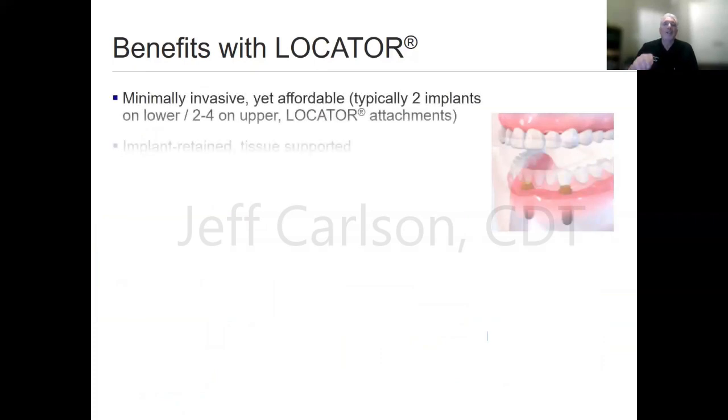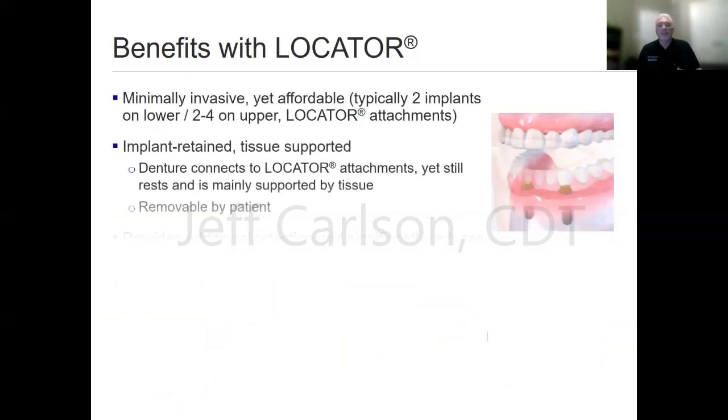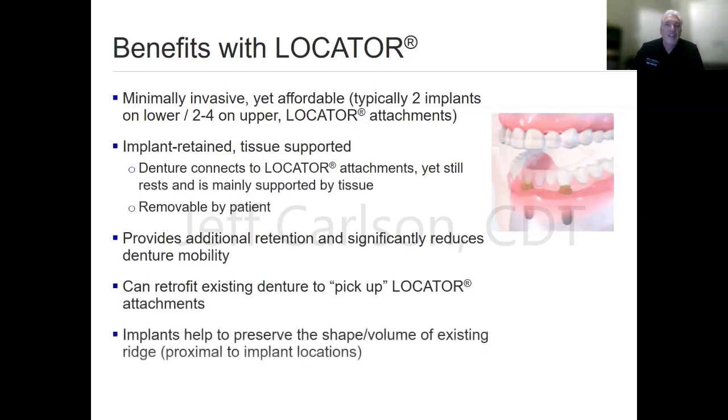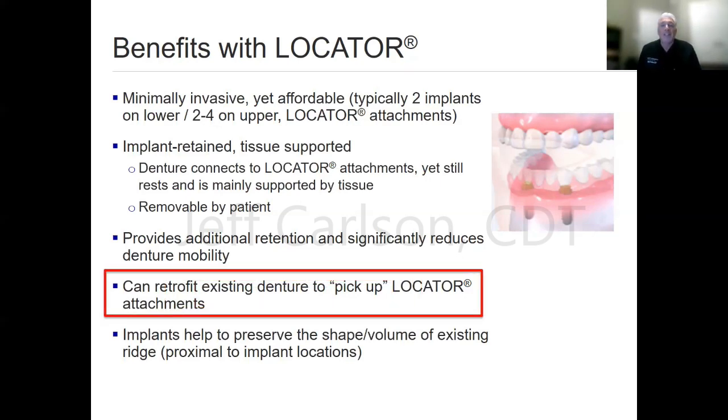So let's talk about the locator specifically and get into some real detail about some applications of all this. It does provide adequate retention, again, based upon the patient's expectations. There is going to be movement, and that could surprise someone. And so it's important that they're aware of that.